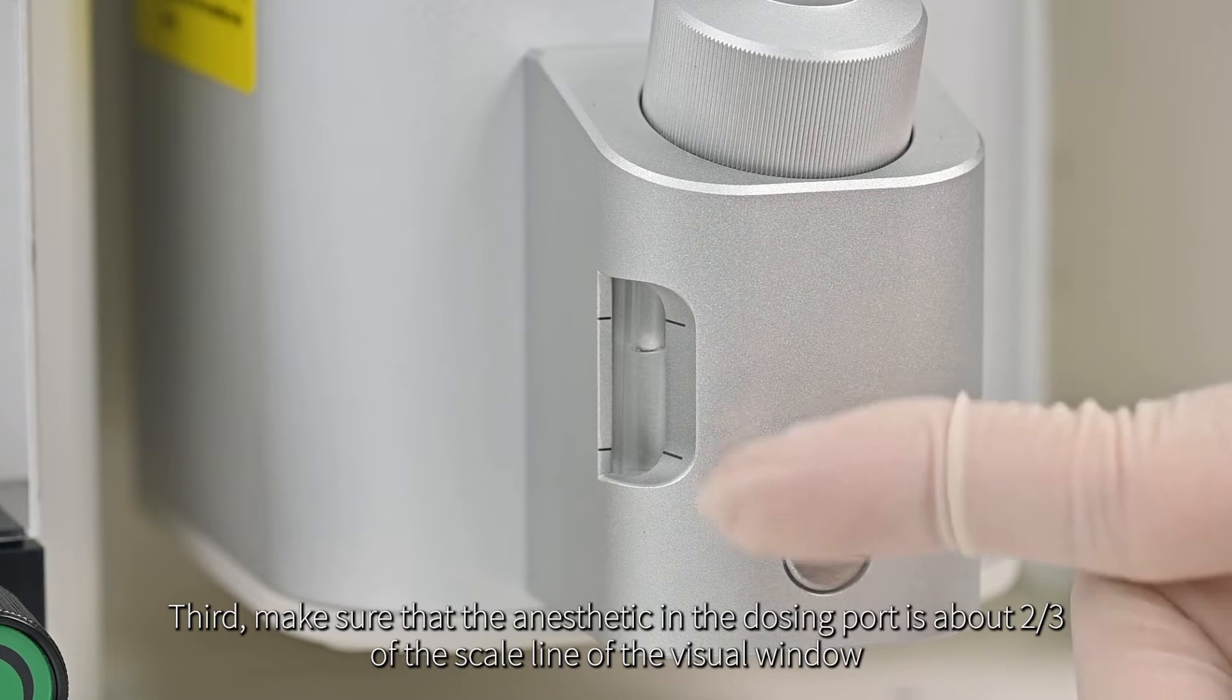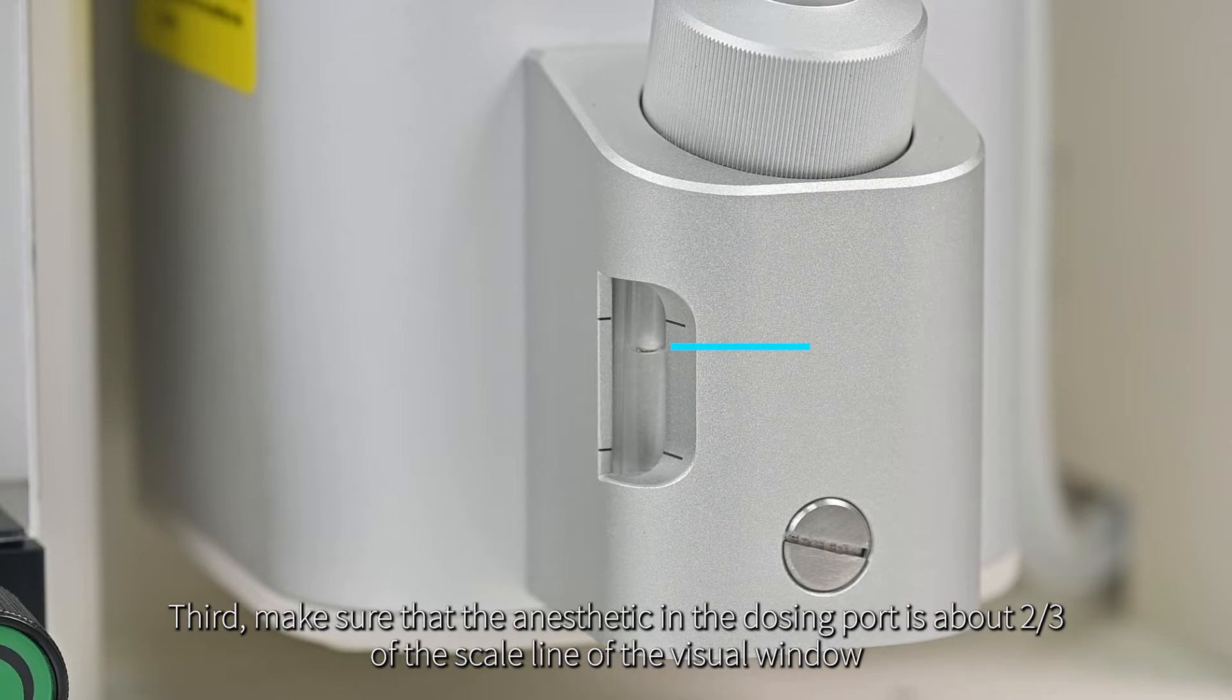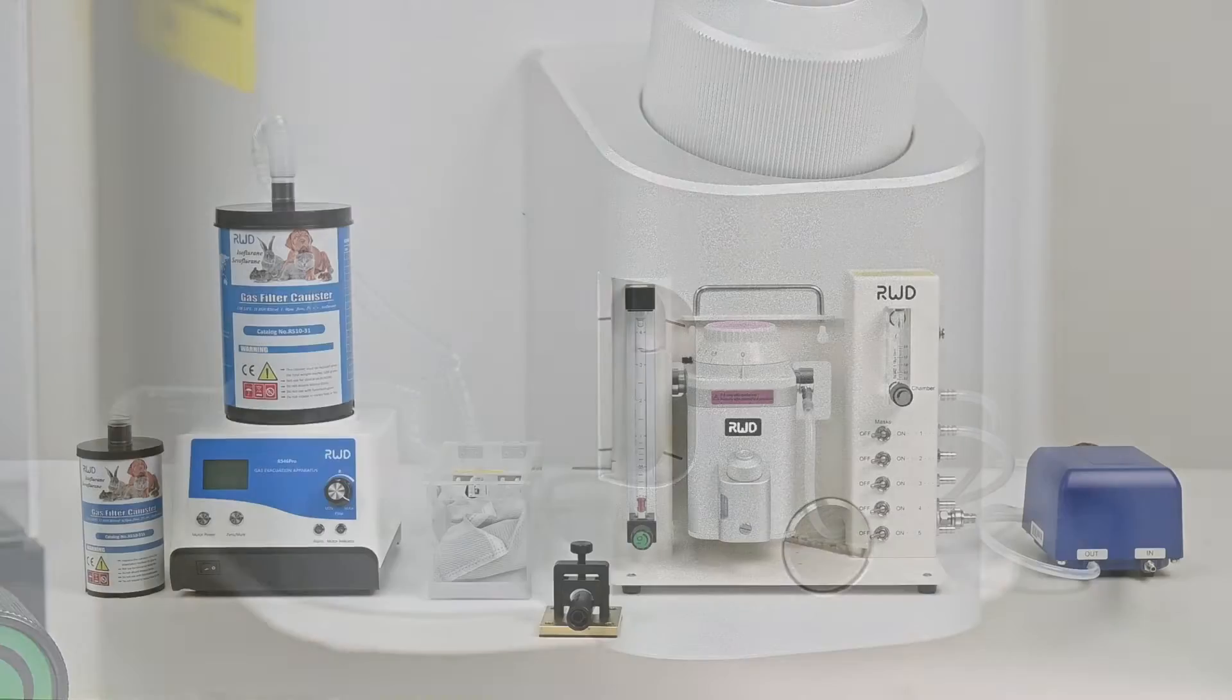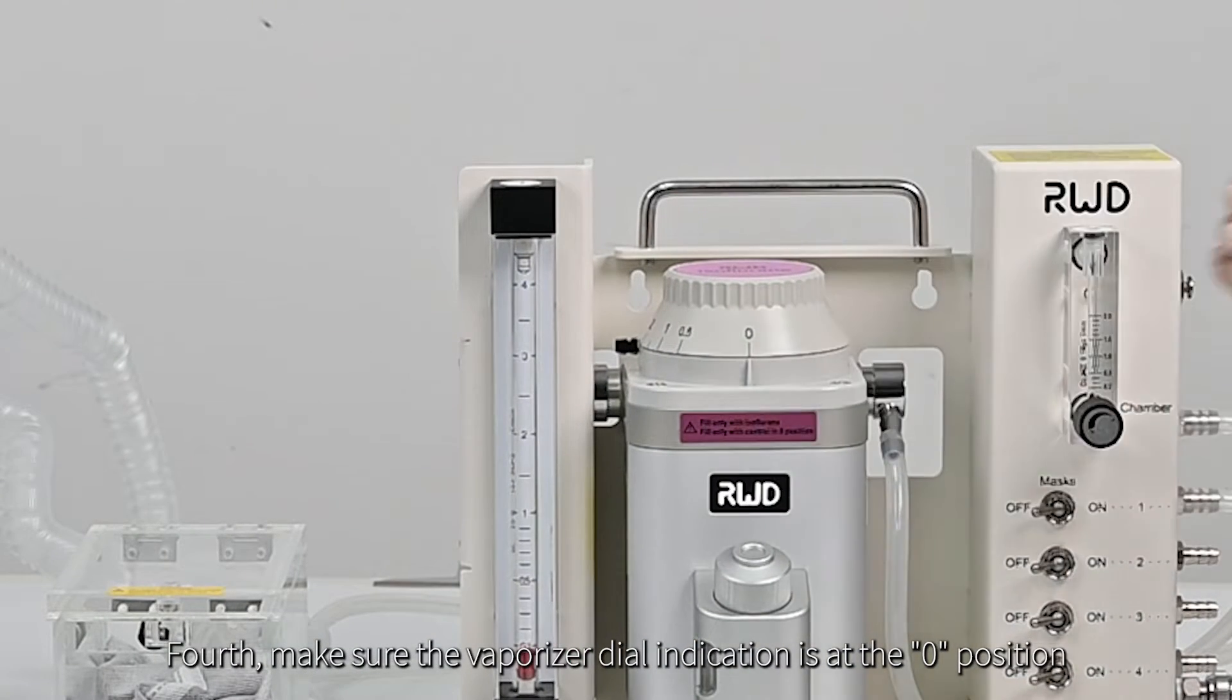Third, make sure that the anesthetic in the dosing port is about two-thirds of the scale line of the visual window before the experiment to avoid the lack of anesthetic causing the animal to wake up. Fourth, make sure the vaporizer dial indication is at the zero position.